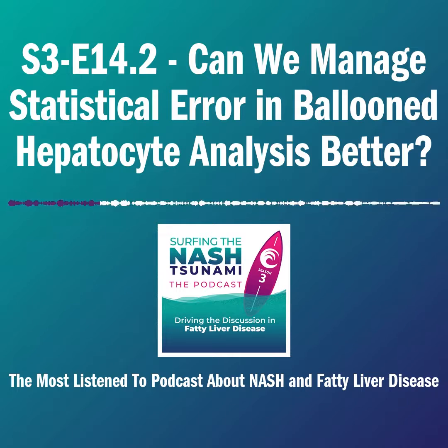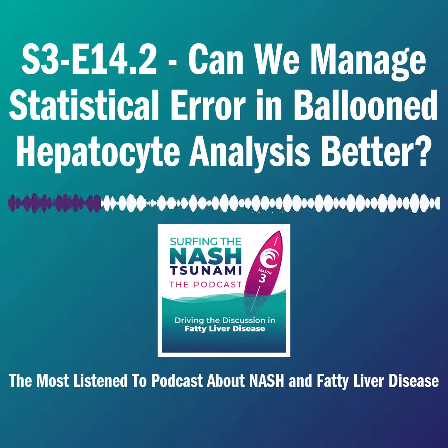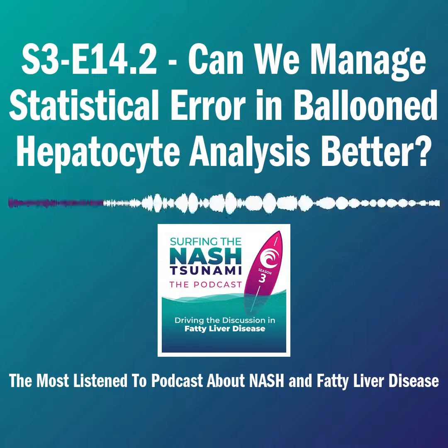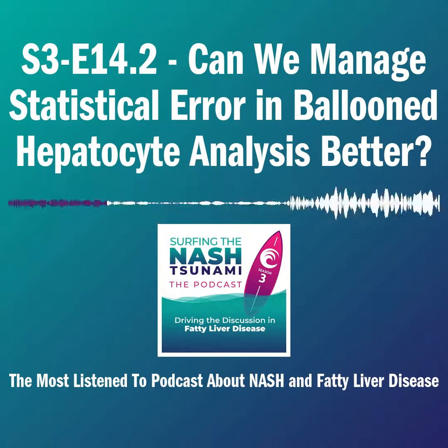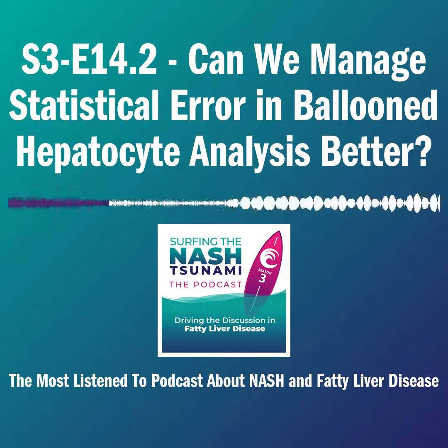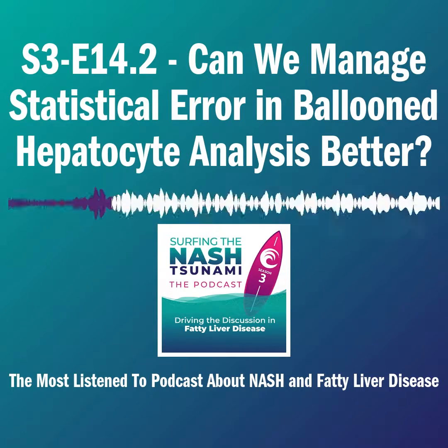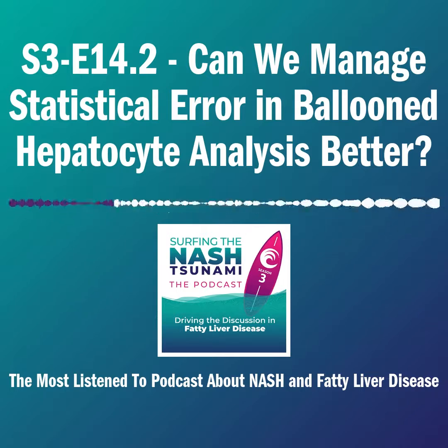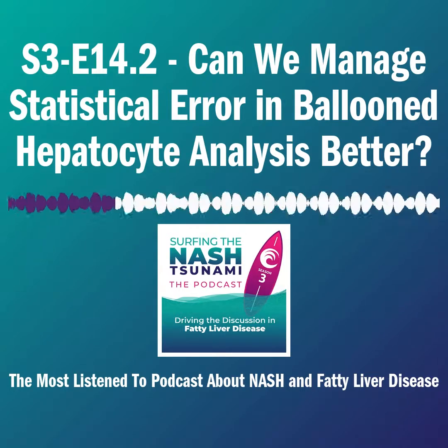I think there are a couple of things we have to remember here. When ballooning was being described, when any of these histological features were being described, it was at that point a shorthand to allow a diagnosis to be made and to assess it in a qualitative sense. Because we are now at the phase of drug development and we're looking for endpoints and so on, we are in effect asking more from the histology than it was ever designed to do.